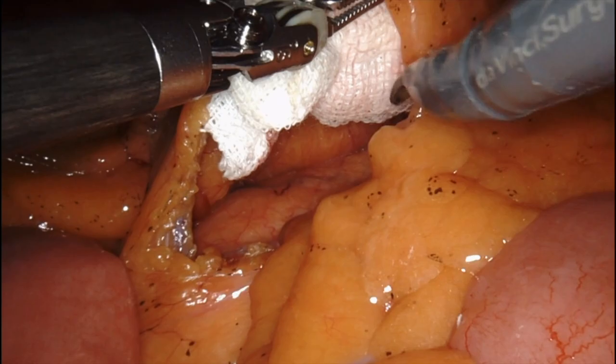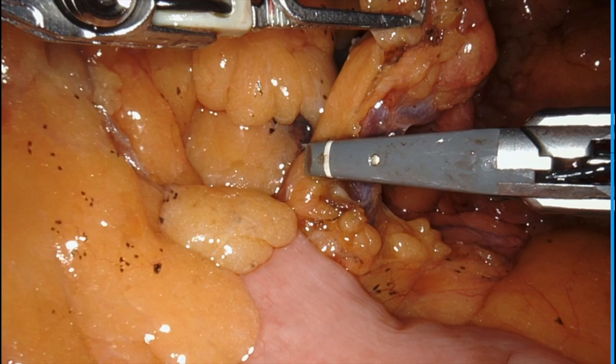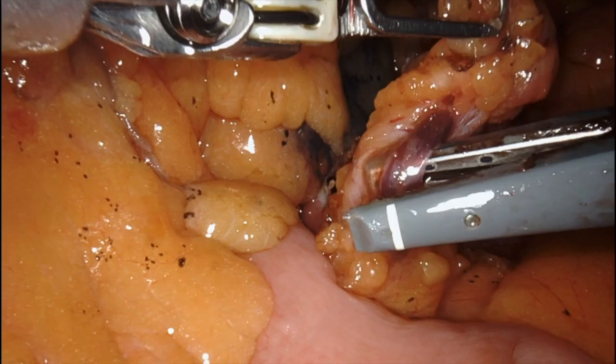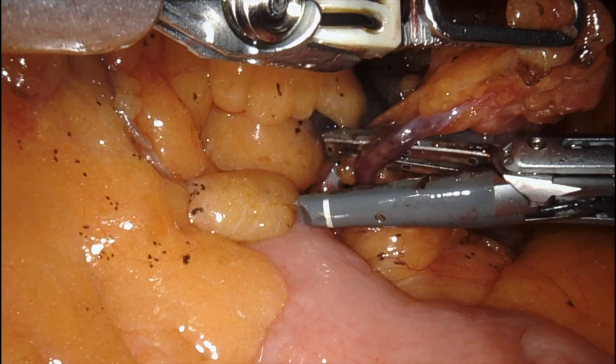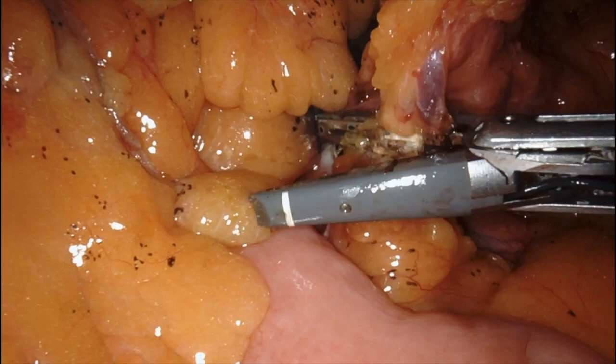I am mostly a hernia surgeon but I also do colorectal surgery from time to time. In my city there aren't many surgeons doing robotic surgery for colon, so I thought this was a very nice case to do robotically. I want to take this opportunity to give proper thanks to Dr. Popovich, whose great videos and generous descriptions make the learning process and execution of these complex procedures a lot better.